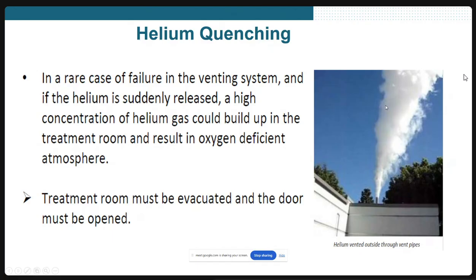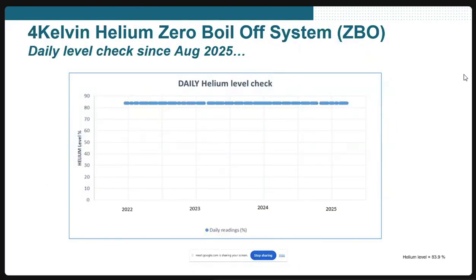But of course, helium is very expensive now with the war going on. You do one quenching, you lose 1.5 crore of rupees. So it's very, very expensive to do this kind of work, and in that process, we have to be very careful.